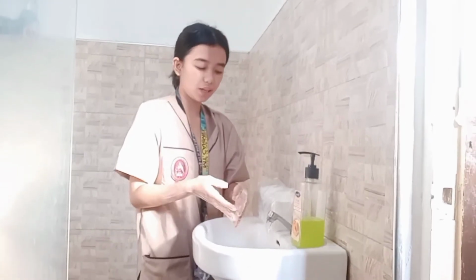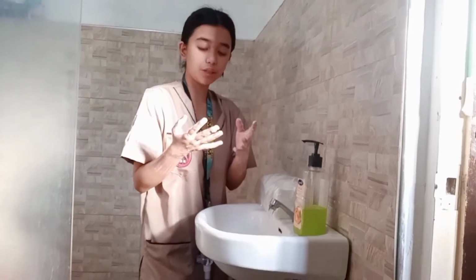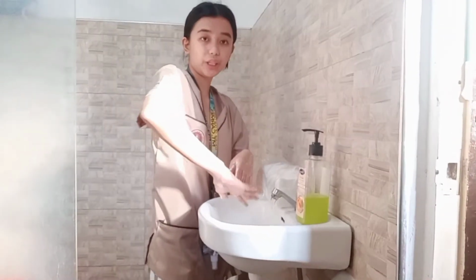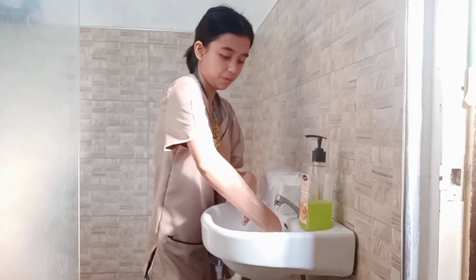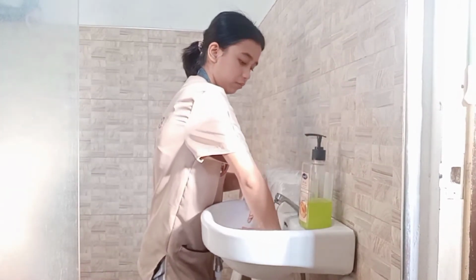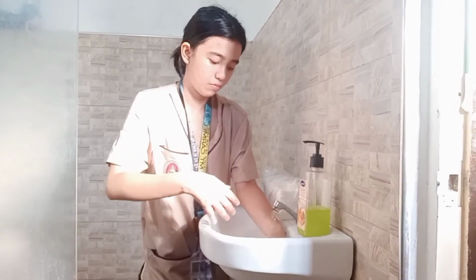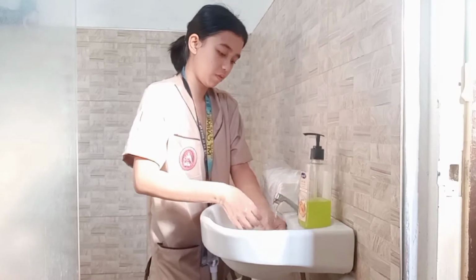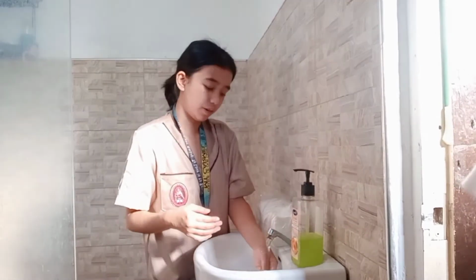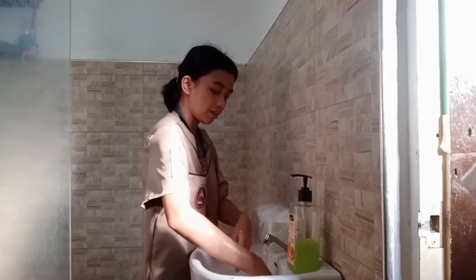So after that, rinse your hands with water. Make sure that your fingertips are pointing downward where the water flows. Rinsing this way allows the water to drain downward.